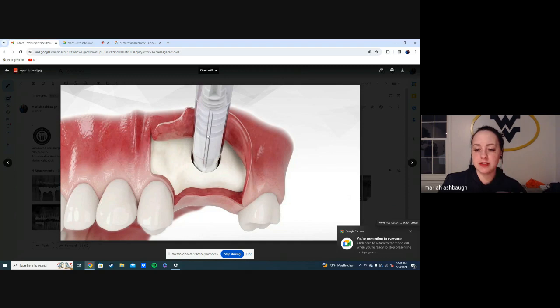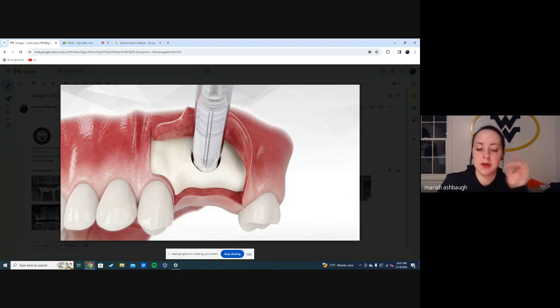Whatever they're doing here, this is different than our approach in our office. We usually do kind of an indented oval. We make our markers into the bone and then go around and push that flap of bone in. I'll show an example in a moment, but really the way I like to describe it is an eggshell.